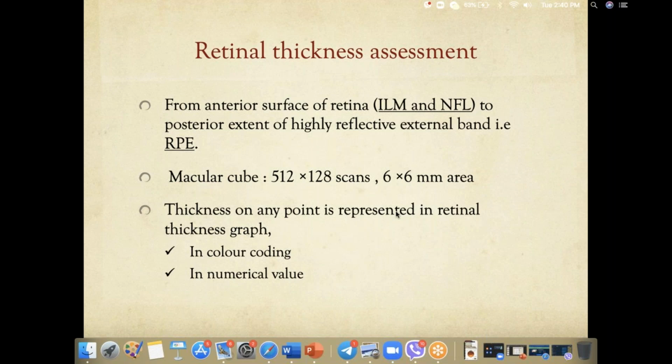Saurav, what is your opinion on that? Just scanning, taking 1 point and making the most of it, that's what I see. That's why most of the treatments are failing, because you don't take into consideration the macular volume. So, what is your opinion on that?